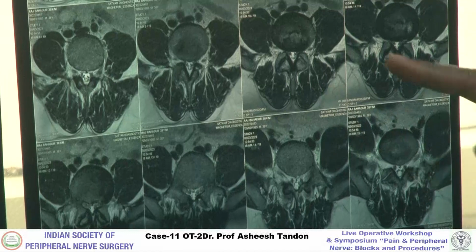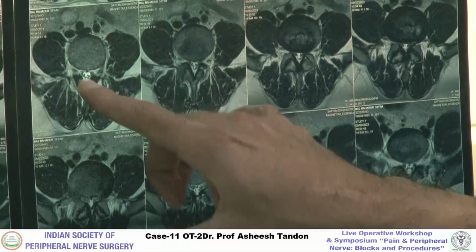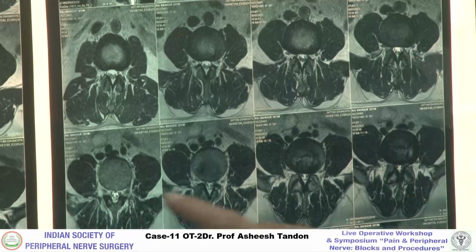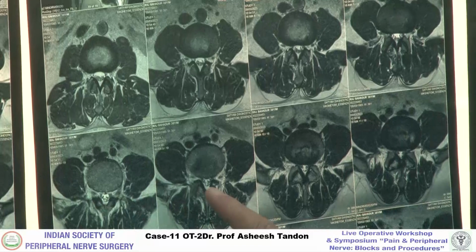Filum, can you show Asheesh? Dr. Mahapatra wants you to. Filum, I can show. Here you can see the filum tail. Not very clearly seen here, but here this, then this cut, then in here. Right. This is the filum going in.